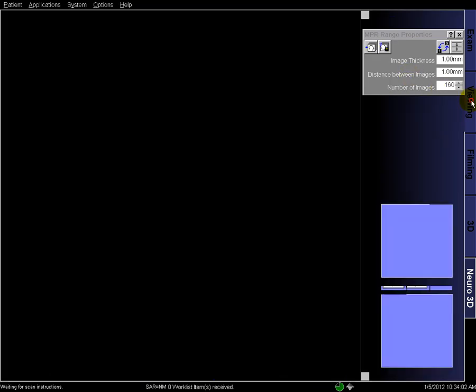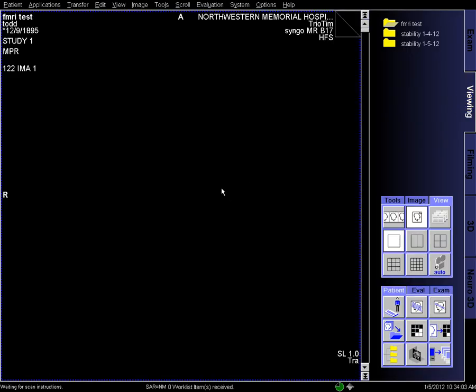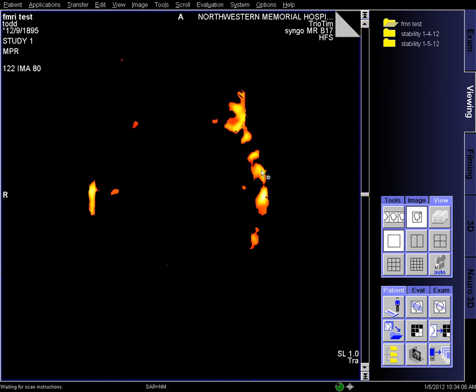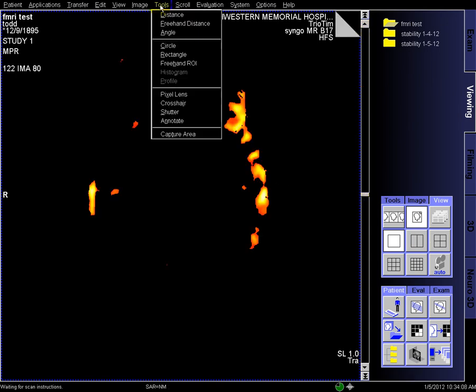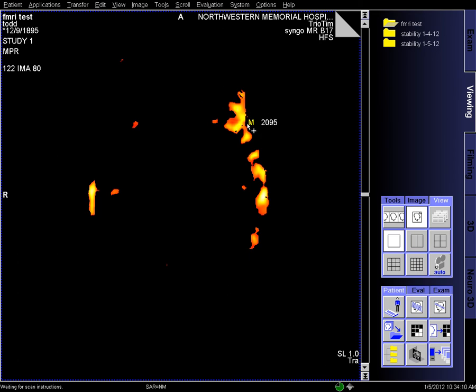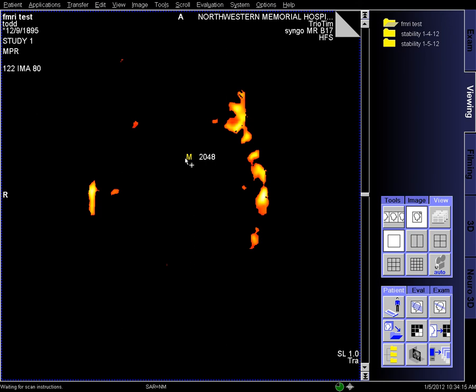Load that into the regular viewer. And as we scroll through, you'll see the different colors. We can turn on the pixel lens and get the intensity, and that's 2500 there, and the background is 2048.